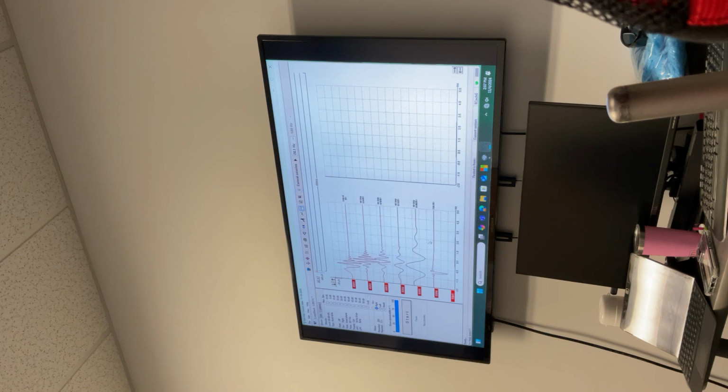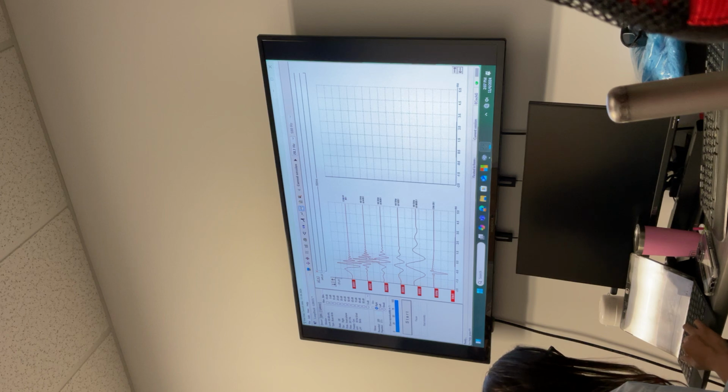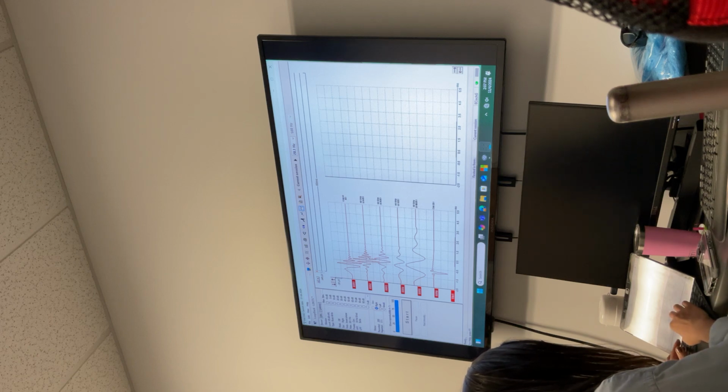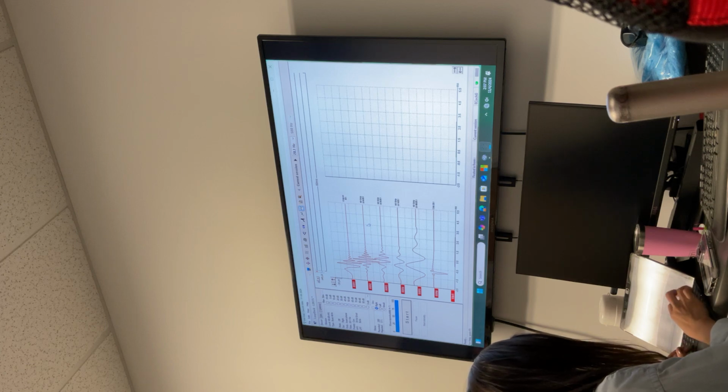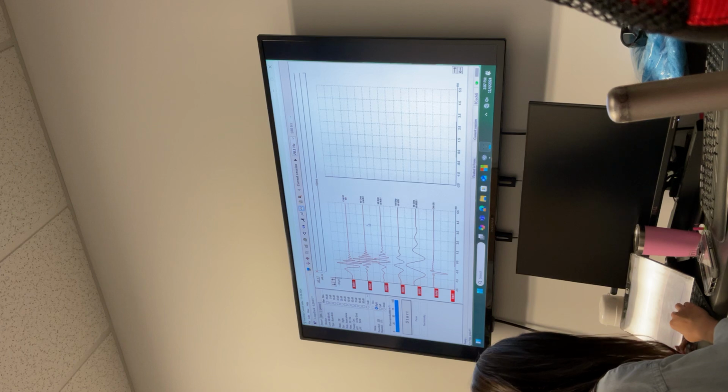Okay. So this is broadband chirp. And within the narrowband chirp, you need to understand that there is compensation for the traveling wave delay going on within that narrow range of frequency. So when a 4,000 hertz narrowband CE chirp is played, the energy is between how much? 2,700 to 5,600. It's an octave band chirp. You need to understand that they are not like pure tone stimulus, what is used in testing. They are 1 octave wide.